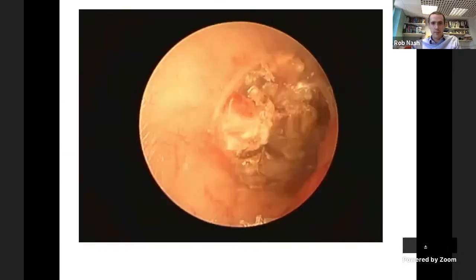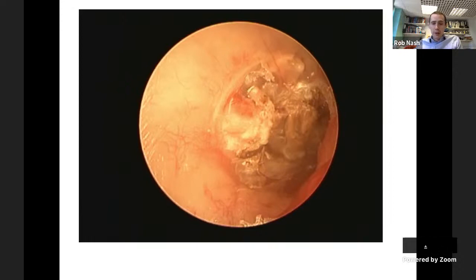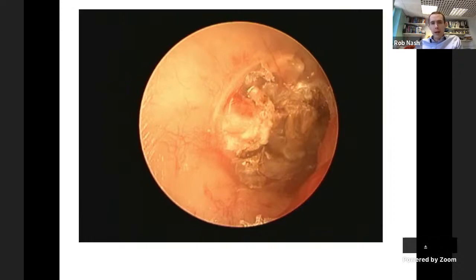This is advanced tympanosclerosis. Imaging would really only be required to plan surgery - the diagnosis is clear. If there's a conductive hearing loss, the reason is clear: there's new bone formation in and around the middle part of the ear causing fixation. Surgery for tympanosclerosis is frequently unrewarding, but if you're going to perform it, you want to know the status of the stapes and whether bone formation has fixed it - imaging can give you a good idea, though it isn't definitive.